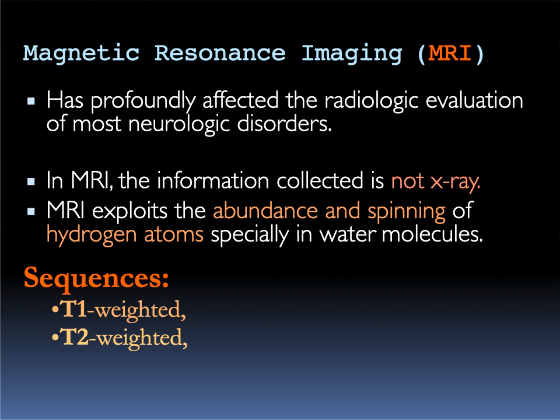Although we cannot give the contrast, which could be teratogenic for the fetus. So no MRI contrast for pregnant women. MRI also, as we mentioned, depends on the hydrogen atoms inside the body tissues. We have the two main sequences: T1 weighted images and T2 weighted images.